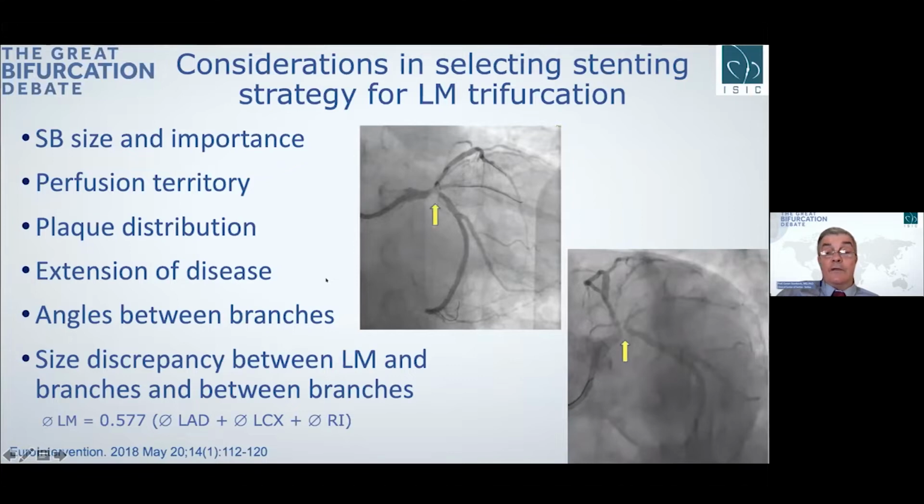And of course, in my way, I just put what is very important for me: the angiographic appearance of the predominant huge plaque amount distribution in front of the ostium of the circumflex. So we know that in general plaque is in the lateral walls in front of the ostium of the LAD and the ostium of the circ.